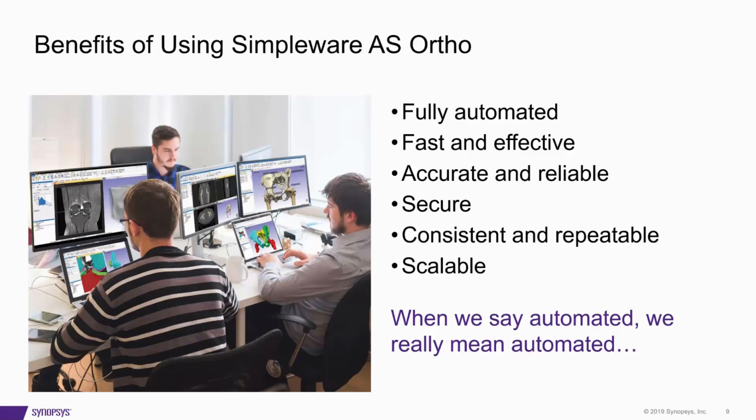It's consistent and repeatable. And this means that you eliminate inconsistencies between users, so you don't need that multiple review that happens so often. It's also scalable, so you can do 1 patient or you can do 50 patients. You can efficiently process large numbers of data sets so much faster. And this really frees up engineering time for more complex tasks or high value tasks. So I've talked a lot about this. Let's actually go and see it in action.